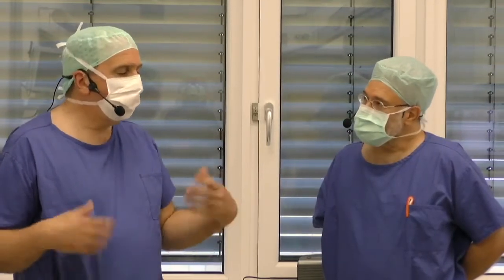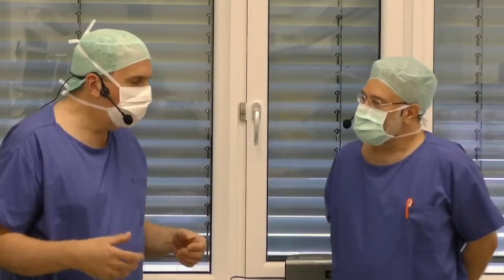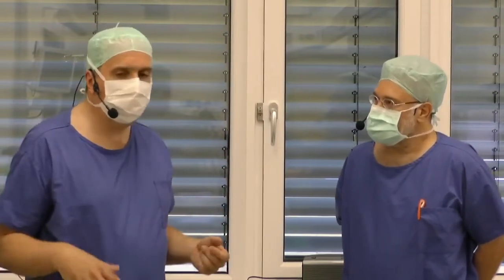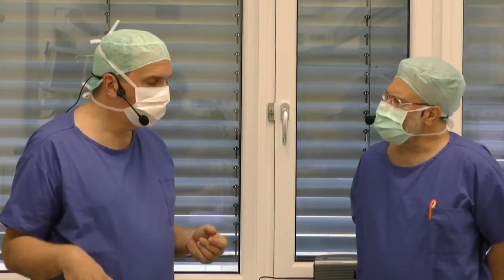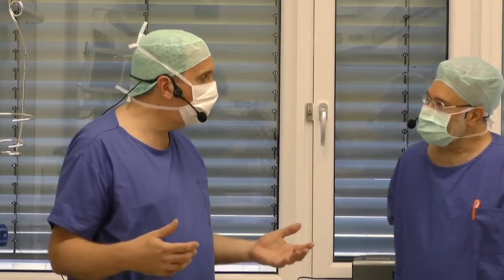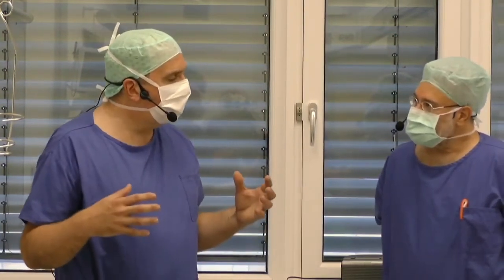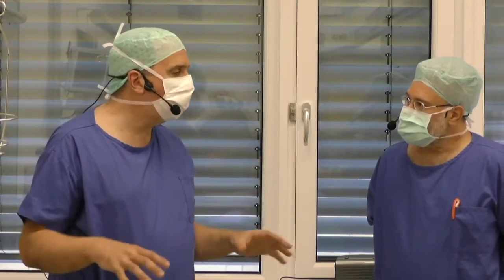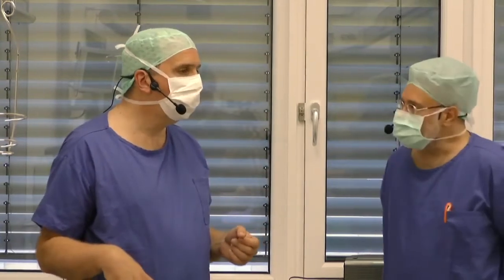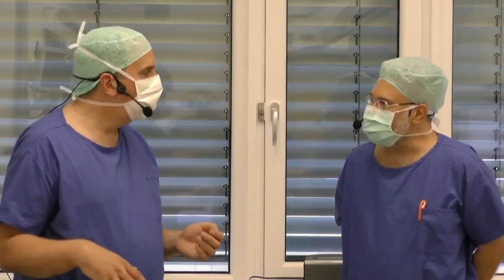And the nano laser, the surgical system, also fits in this procedure and in this strategy because it's less traumatic to the eye, which is very important if you do both eye surgery. What do you mean by less traumatic? Less traumatic means small incision, no thermal gradient, no mechanical shockwave-like effect. Absolutely less energy given inside the eye compared to phaco. I've noticed that this eye was performed with under 500 microjoules of energy. Yes, that is almost a minimal amount of energy.